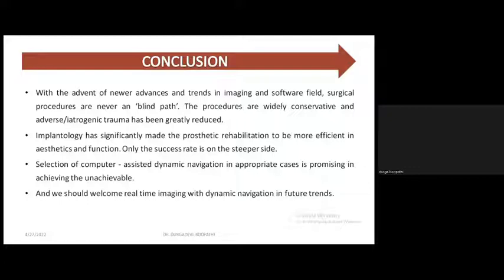And also, I will give you a hint about the future trends. That could be even real time imaging. Even though you will do a pre-surgical implant planning, even real time, there might be a CBCT machine that will be continuously taking images. But of course, the dosage, radiation exposure, and all is there. But it's just a gist from the future. This may not be useful for dental surgeries like implant surgeries, but it could be useful for oral cancers involving minute nerves and lymph nodes and all those things, head and neck region, definitely for neurosurgery. And I hope it's a very interesting topic.